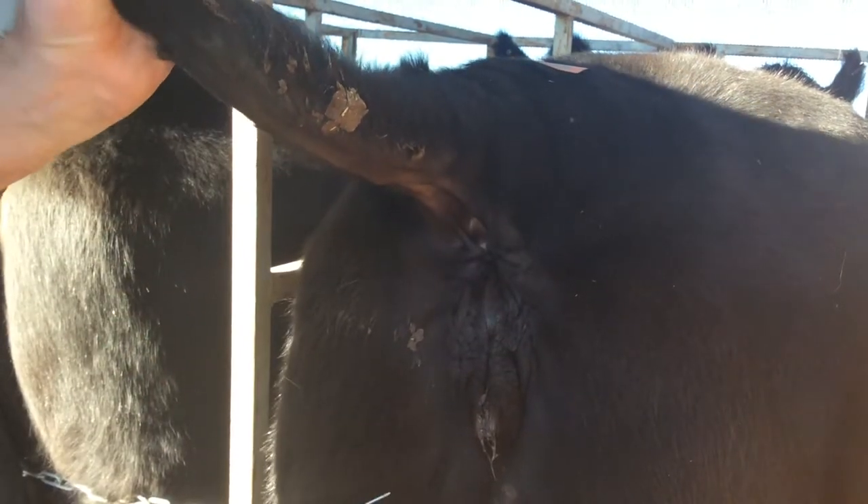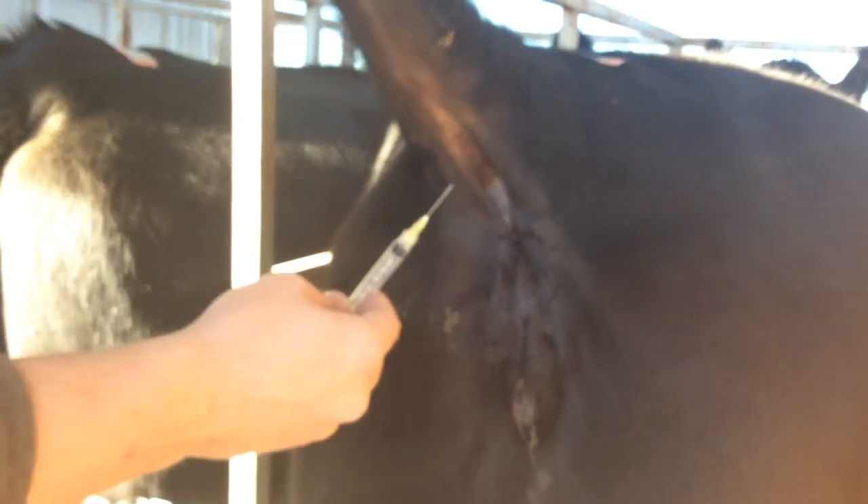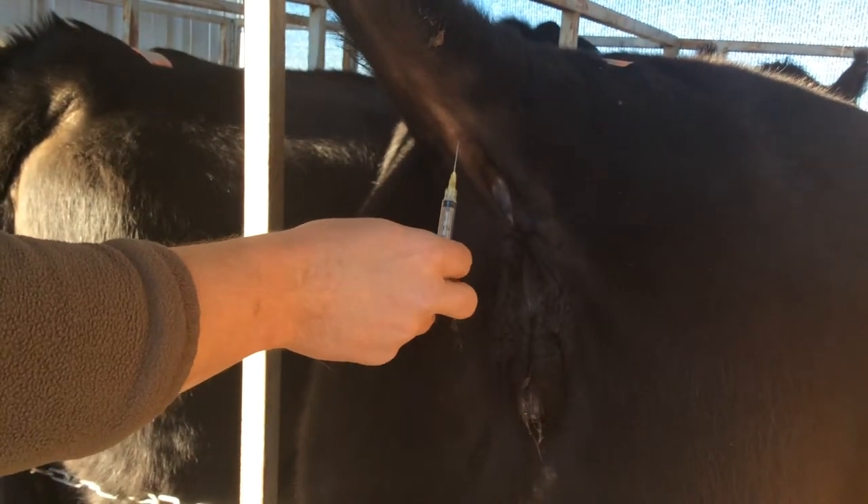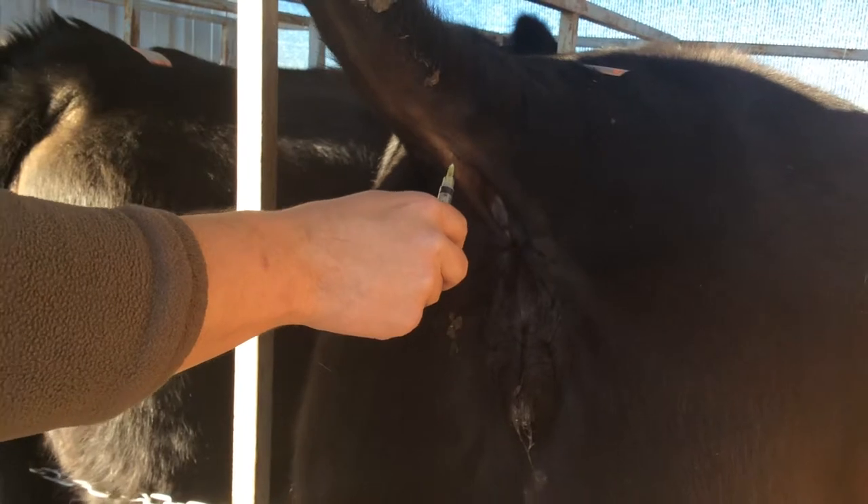Lift up the tail vertically. Look down the midline of the tail and you can see a little groove where the vein runs. Pull back on the plunger of the syringe as you insert the needle perpendicular to the tail.